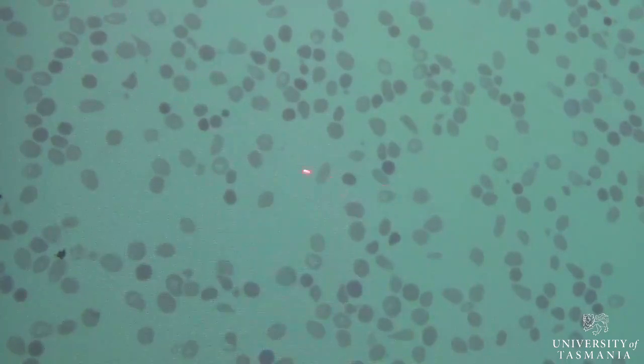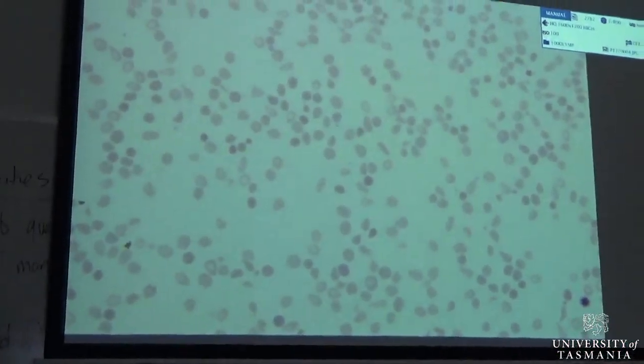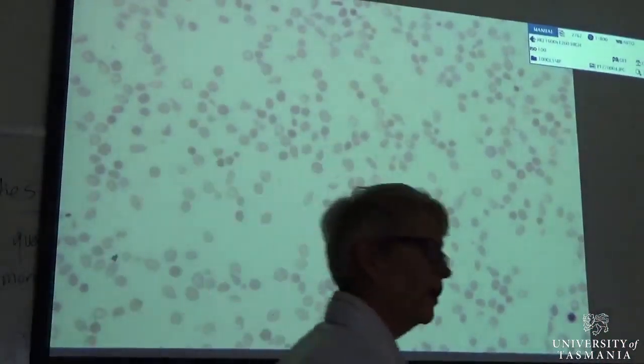There's a lot else going on as well, but there's definitely some spherocytes. So these dark cells are spherocytes, and there's also some slightly larger ones. These ones are more purpley. That one in particular is more purpley. And so there is some polychromasia going on here, as well as all of the other things that are more associated with the fact that there is a beta thalassemia underneath. So beta thalassemia, as you learn about next week, is one of our microcytic anemias.